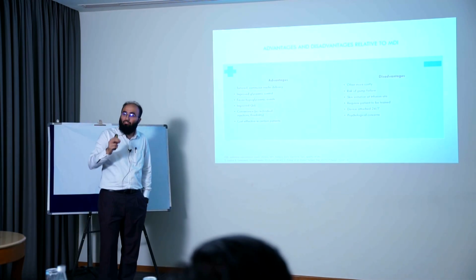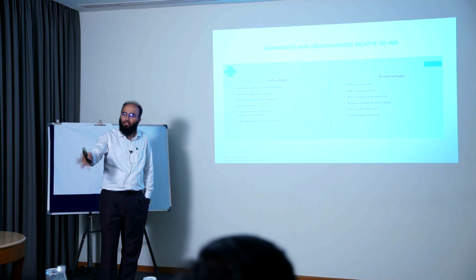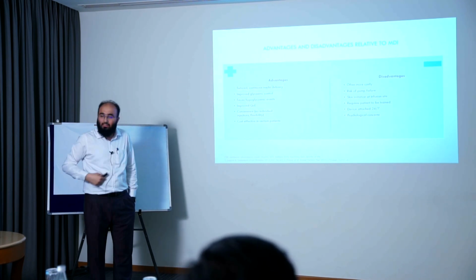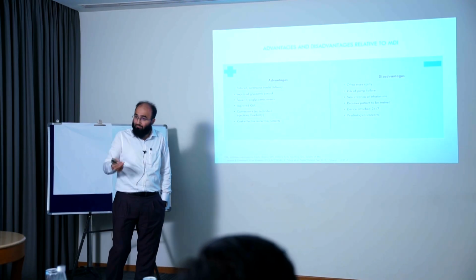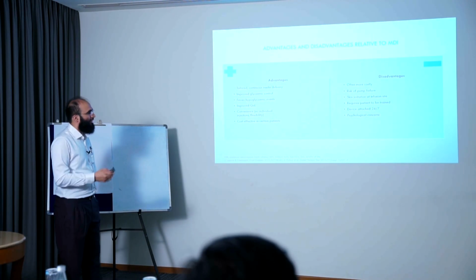However, if it is because of a prolonged indwelling catheter, this patient is not changing it. 7 din ho gaye, 10 din ho gaye, he is continuously using it just because the pump is not giving any alarm. So that might cause infection, abdominal wall abscess. I've seen abscesses. Device attached 24/7 and psychological concerns also.